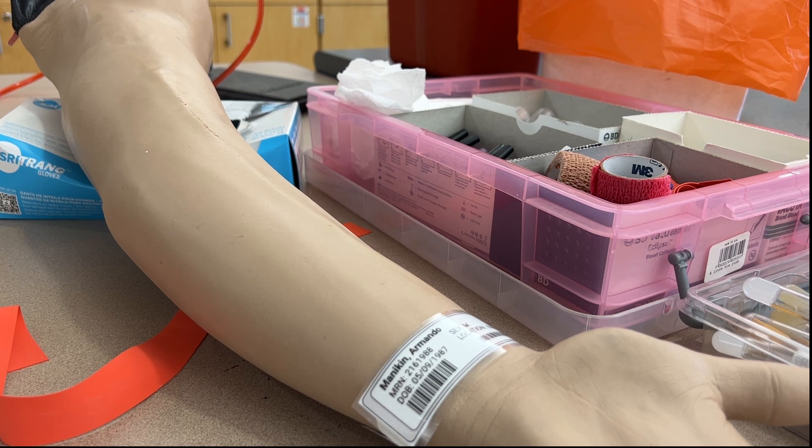The first thing we want to do is greet the patient and tell them why we are there. Then we want to positively identify the patient by asking for their full name and a unique identifier such as their address, date of birth, or medical record number. We want to avoid asking 'are you Armando Manikin?' because they might reflexively say yes. If the patient has capacity they should supply an answer and we can be assured that that answer is correct.